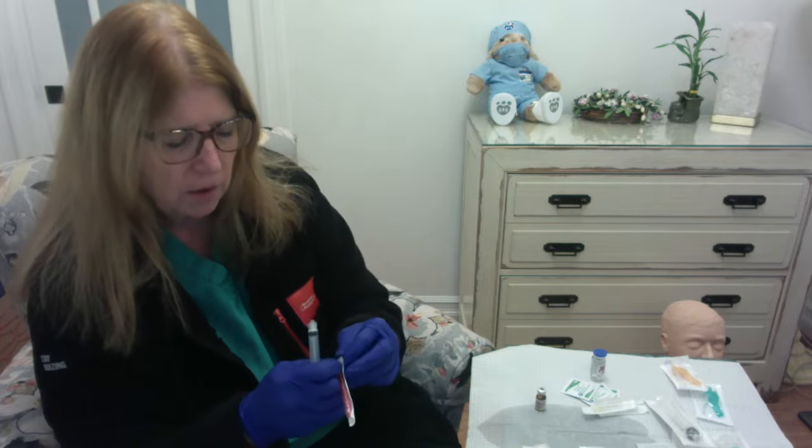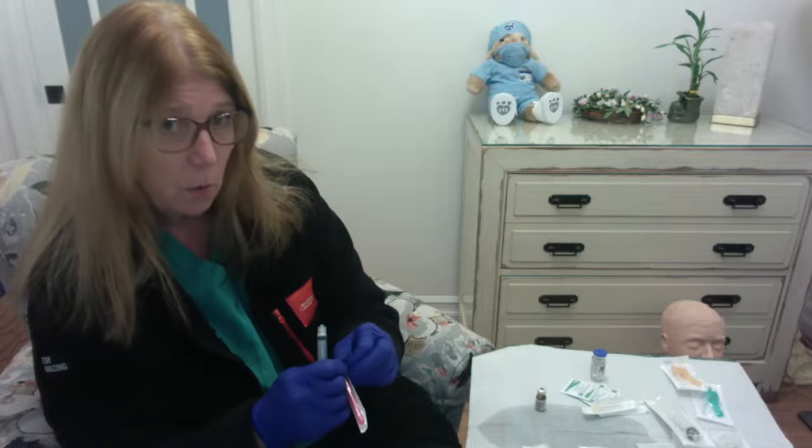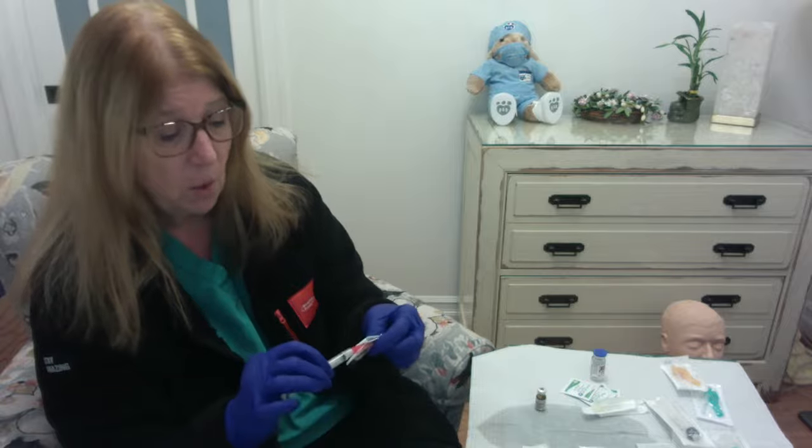A blunt needle is a needle that doesn't have a point at the end. So you would never want to use a blunt needle to inject a patient, right? Because it doesn't have a point on the end, it's going to be quite painful.